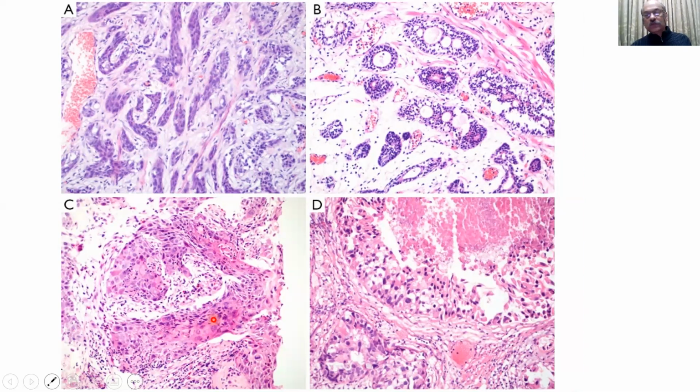Then this one is carcinoma with squamous differentiation. Here, the tumor cells grow in nests with cytoplasmic atypia, and they also show an infiltrative pattern. And this one is urothelial carcinoma of the prostate. They are actually identical to urothelial carcinoma. They present extensive areas of necrosis.